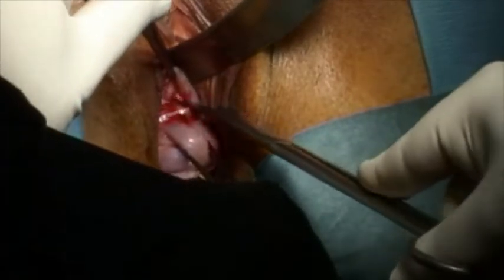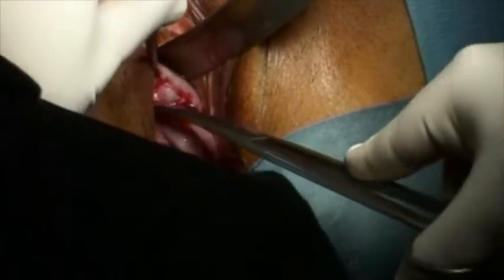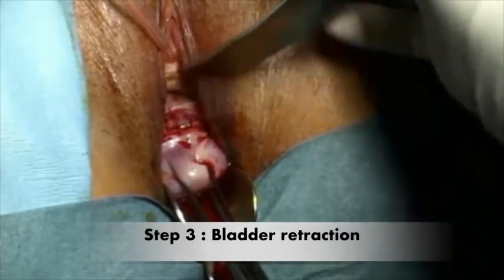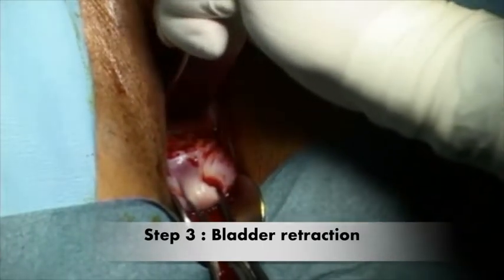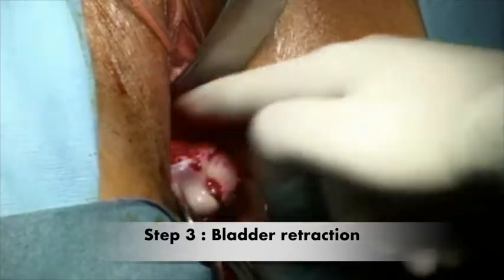The third step consists in performing a dissection of the vaginal wall and the uterus with scissors to enable bladder retraction and exposure of the cervical isthmic junction. The bladder has to be reclined with a vaginal valve.